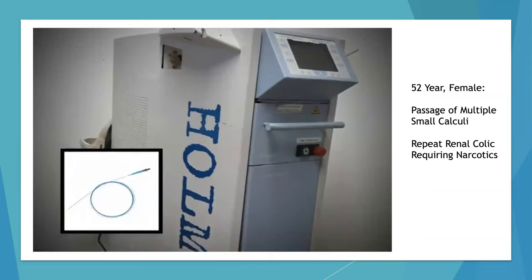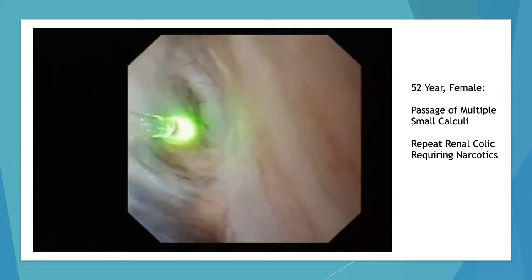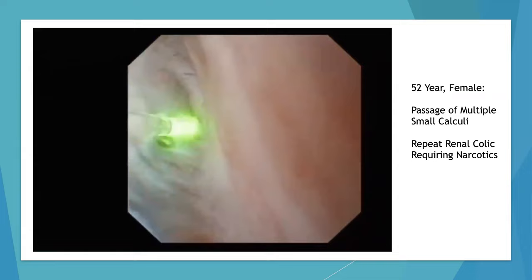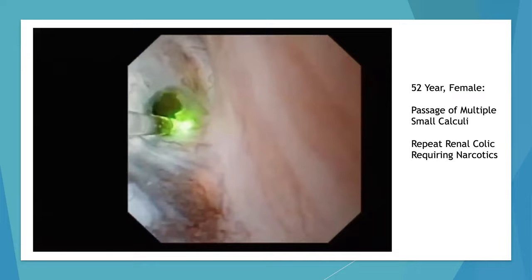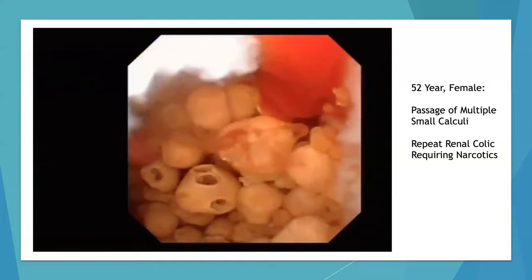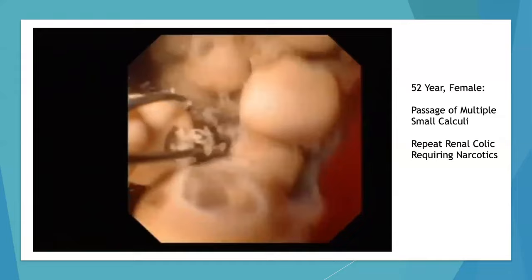We used the holmium laser for management of the stone and to open up the infundibulum. Once the caliceal diverticulum was localized, the laser was used to open up the connecting tissue. Once the diverticulum was opened, multiple small calculi were identified. The stone basket was used to extract the stones, and the holmium laser was used to fragment the larger fragments.